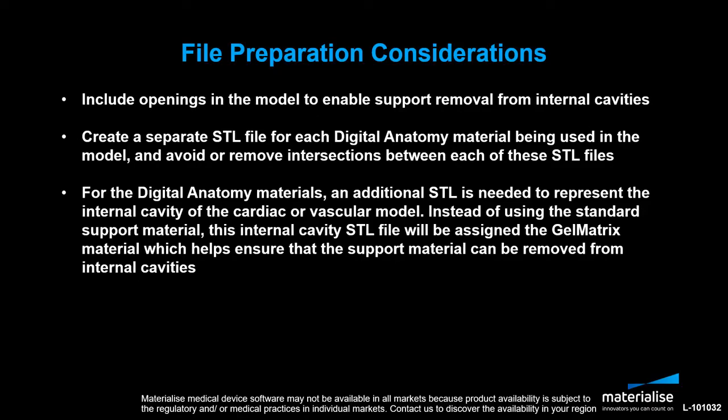In this tutorial, we will focus on the last point, creating a STL file to represent the internal cavity of the model for the gel matrix material assignment.